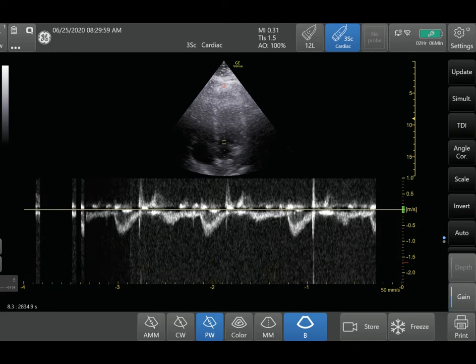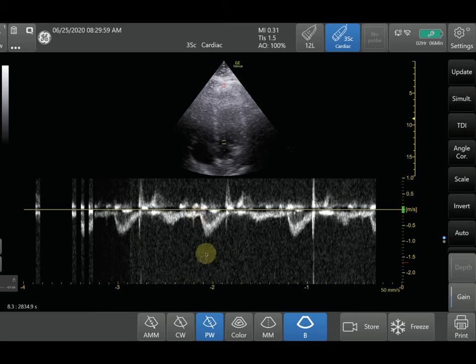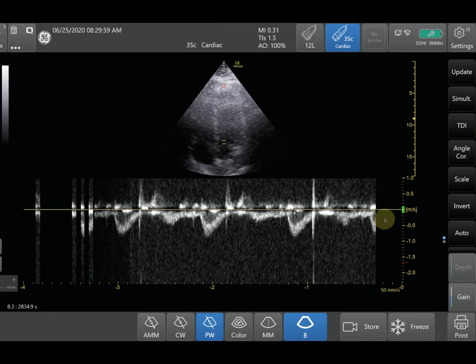After optimizing your gain, you can adjust the baseline — the horizontal line on the display. If you're measuring a structure with flow going downward, bring the baseline up so you can see more of the downward tracing. Conversely, if the tracing is going upward, bring your baseline down to get the best view of your measurements.